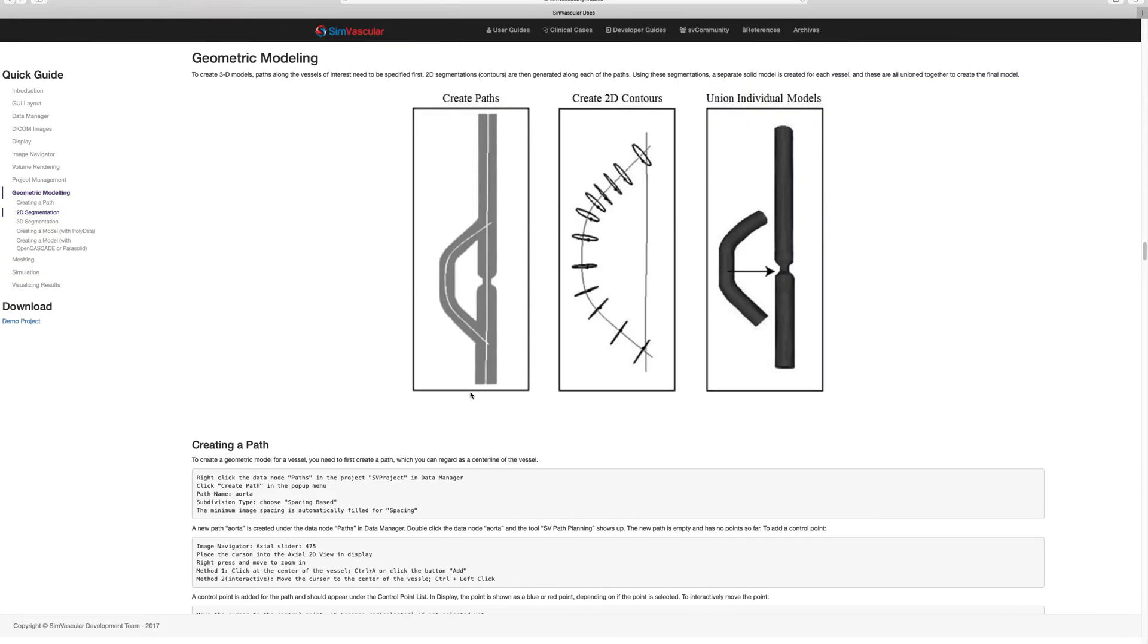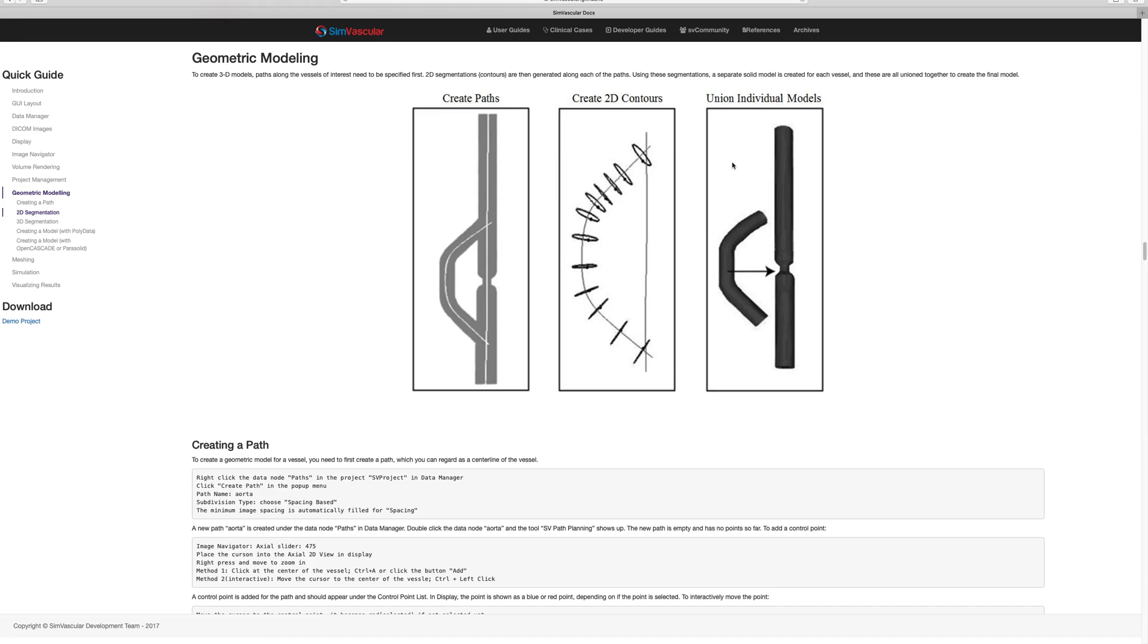Okay, so in today's tutorial we'll continue in the geometric modeling process. Last week you've seen how you can create a vessel path from imaging data, where you would create the path at the center line of the vessel. Today we will continue by creating 2D contours along this vessel path. Then in a later step you will learn how to loft those 2D contours to an actual 3D model.